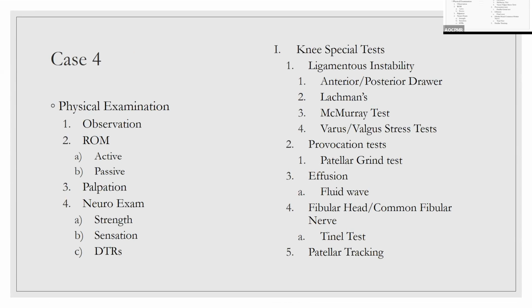One more, case 4. Let me remember. Oh, this is a great one. Very osteopathic one. This is the case of a 23-year-old female athlete who presents to me with right-sided intermittent foot drop. She was a soccer player and noted a collision while going for a standing tackle. Somebody basically shinned her on her lateral lower leg, lower knee. Ever since then, she's had a lot of pain in the lateral knee, and she noticed herself limping more and more. Now she notices that when she goes to kick, especially repetitively, she has more pain and weakness in dorsiflexion.